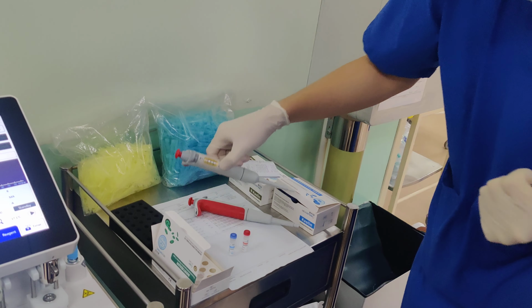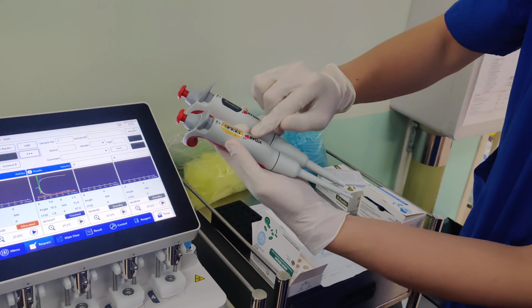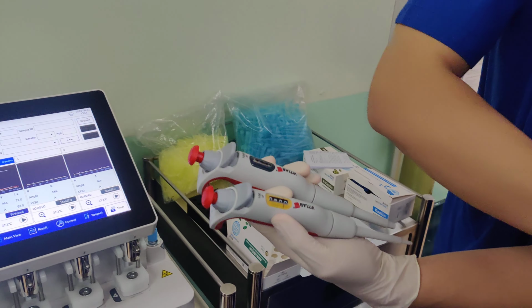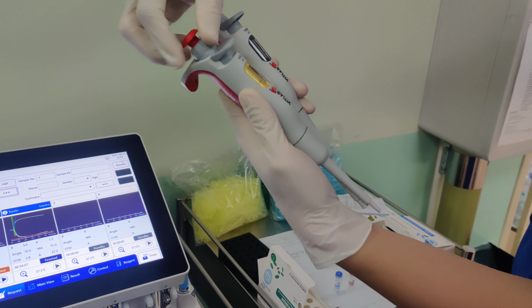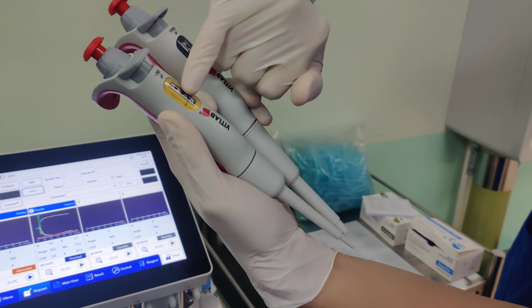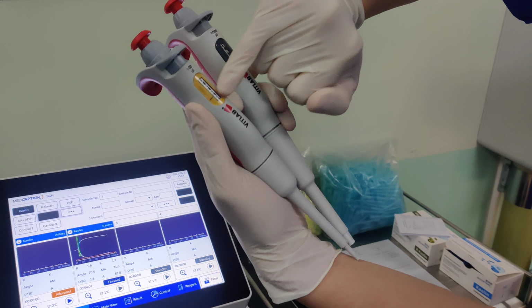And then they said pipette, right? So there are 2 types of pipettes also. One is for smaller volumes, one is for bigger volumes. Since this one is 20, pipette 20 microliter, we will set it to 20. So you can see it's already been set. 20. This dash here is point, decimal point, 20.0.